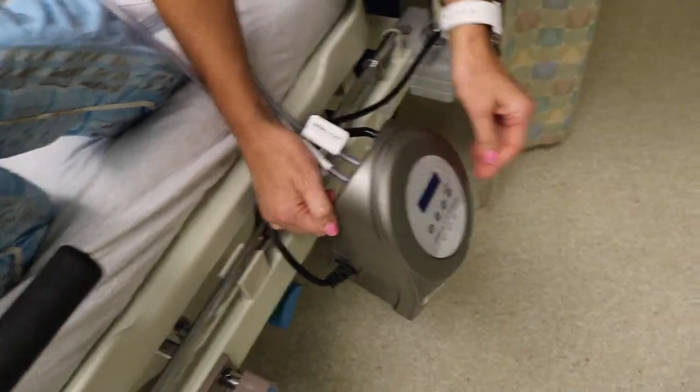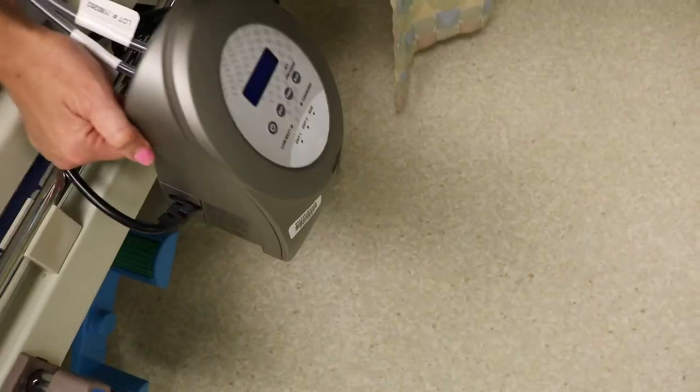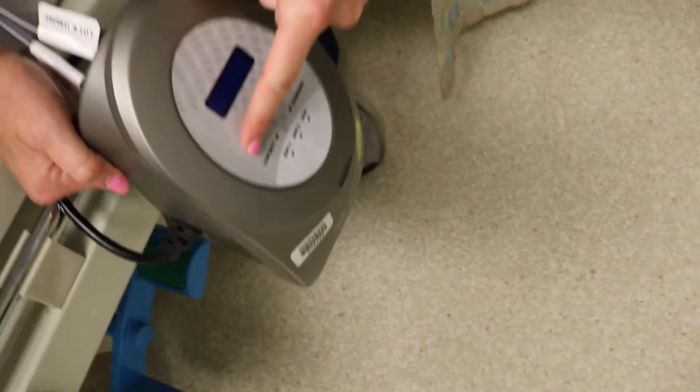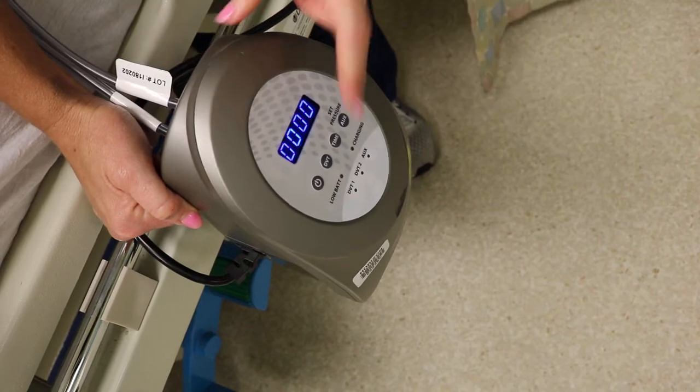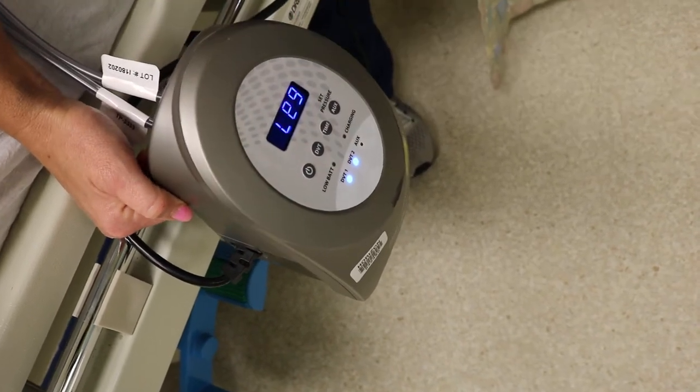Our machines are pre-programmed, so it makes it easy for patients. You simply hit the power button, and once the machine is on, all you have to do is hit the DVT button one time.